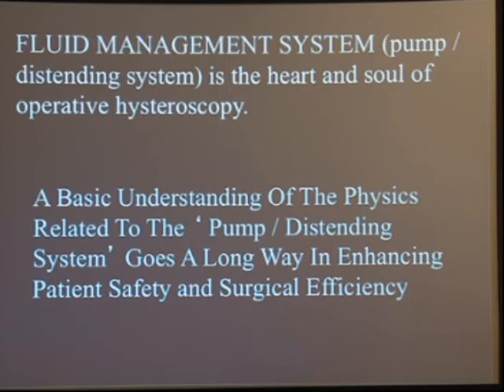Office hysteroscopy is an easier go. All that you need is distension. You're not going to be doing major operative work. You're going to have limited operative work. So the absorptions become a parameter which need to be looked after, but they're not of superb importance as in operative hysteroscopy, when you are doing myomas, or adhesions, or big endometrial resections.